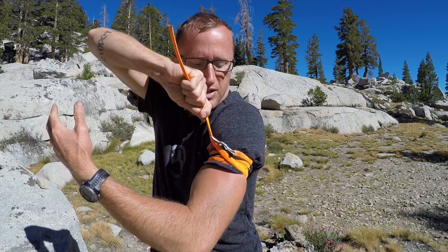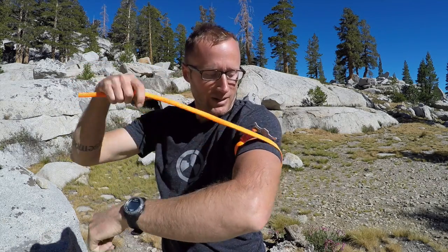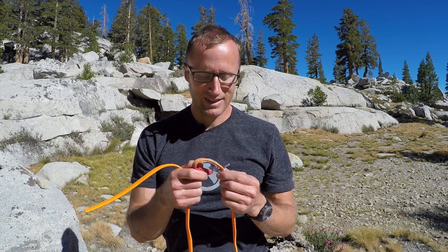Now at this point, to secure it, I'm going to slide this piece into the cleat. I'm not going to do that because I don't have anyone to help me get it out. If you are practicing this by yourself — which you should definitely practice — maybe not necessarily alone. I would be very wary of throwing that thing and sinking it into the cleat if you're by yourself practicing one-armed. Ask me how I know.